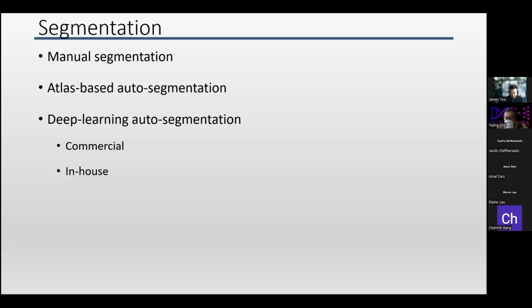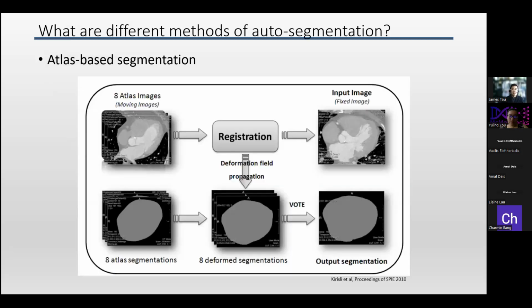I should note that as of now, there are many commercial segmentation tools. When I started the project, there were not many. But the commercial segmentation tools, they're all FDA approved, Health Canada approved, but none of them were validated in the pediatric population. In fact, they don't have FDA approval to do children's auto segmentation. And the other method that I'm going to propose today is in-house. Again, it's an example of how you can leverage what's already been done in the literature, but in a clinical setting.